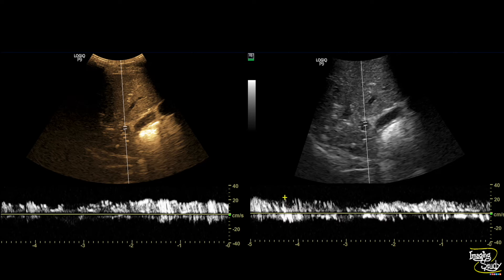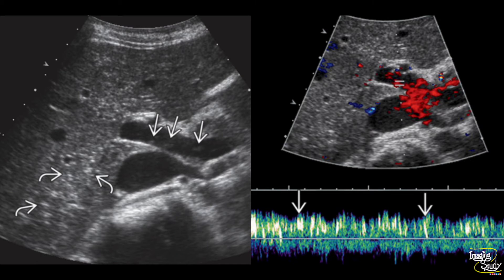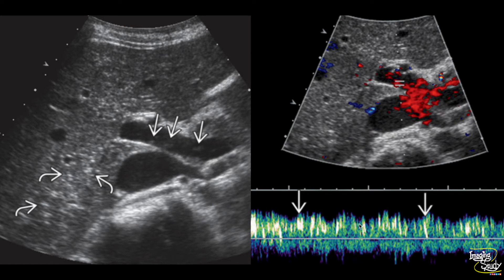Here you can see an oblique ultrasound of the liver showing several echogenic foci in the portal vein representing gas bubbles. You can also see brightly echogenic patches in the liver more peripherally, representing parenchymal gas. On the right image, an oblique pulse wave Doppler in the same patient shows strong high intensity transient signals appearing as vertical spikes within the main portal vein — in the same direction as portal venous flow.